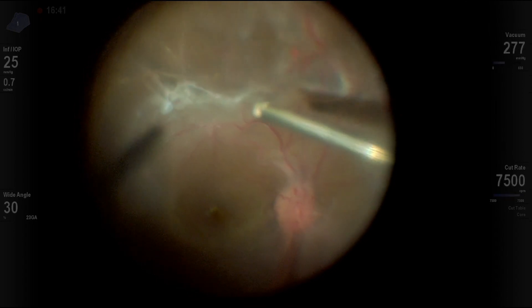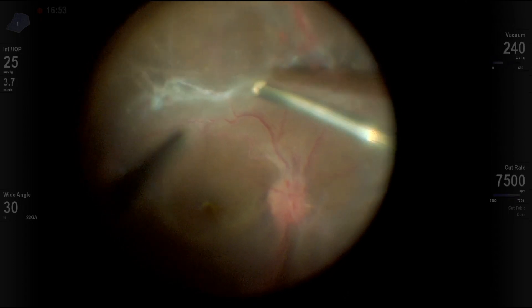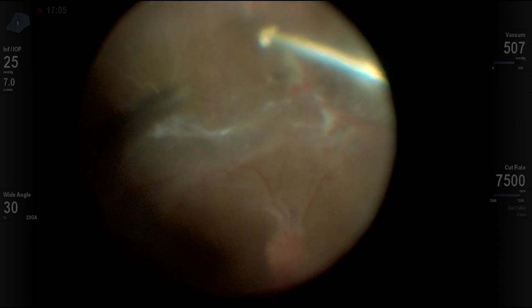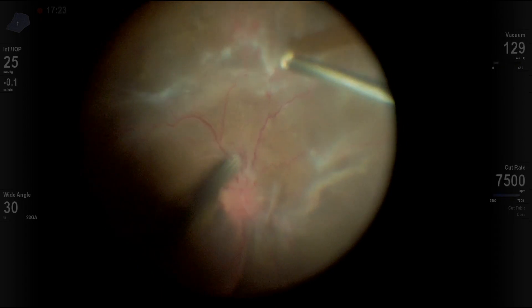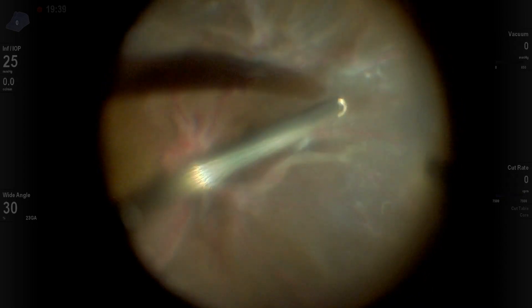As you can see here, the vitreous is attached with areas of traction which I'm trying to relieve, again going from in out. This is a long surgery — it took about 3 hours — and here most of the clips are sped up from 2 to 4 times, and of course it's heavily edited.